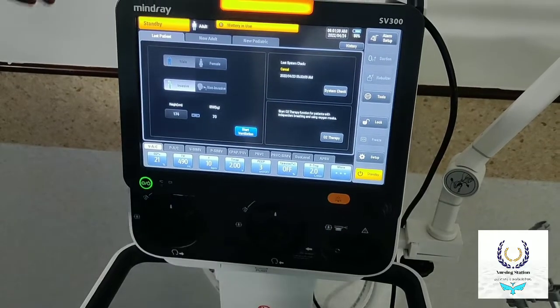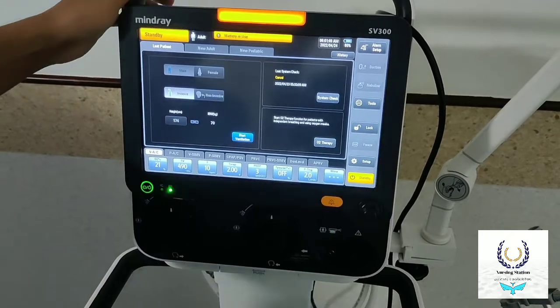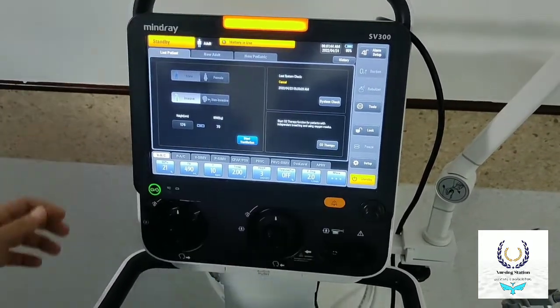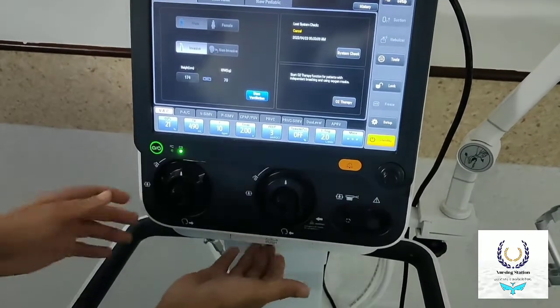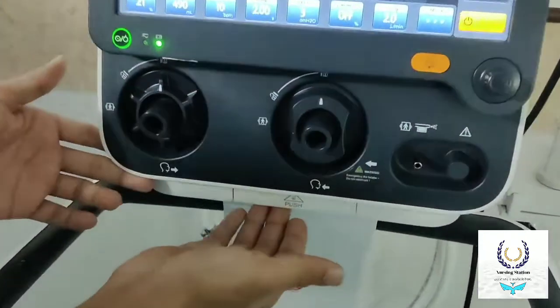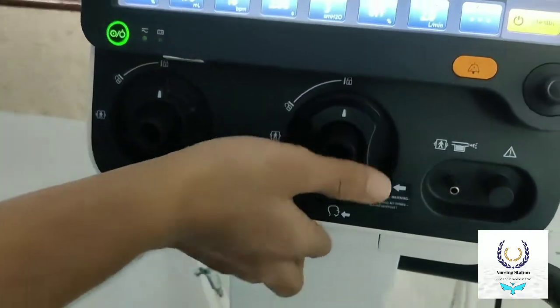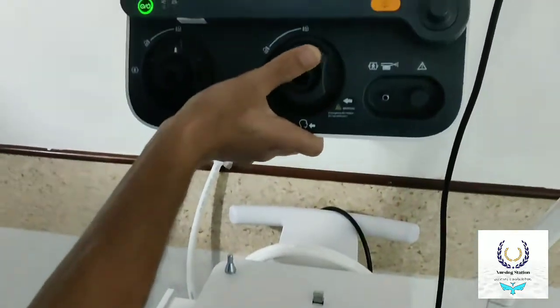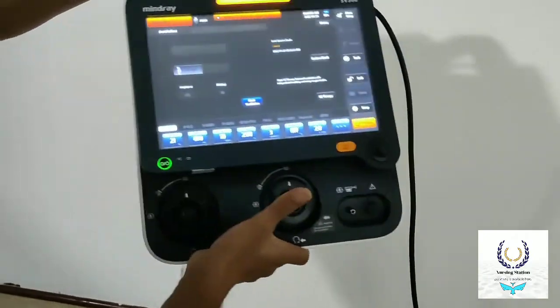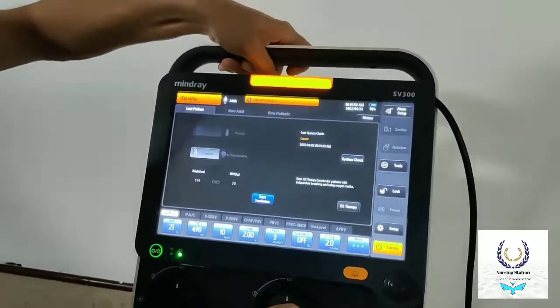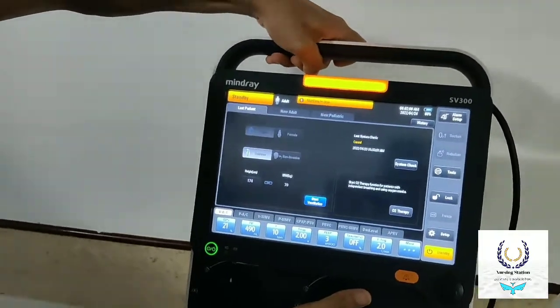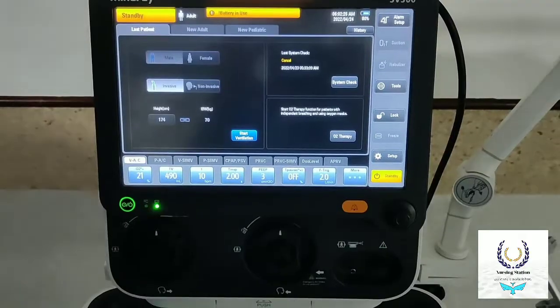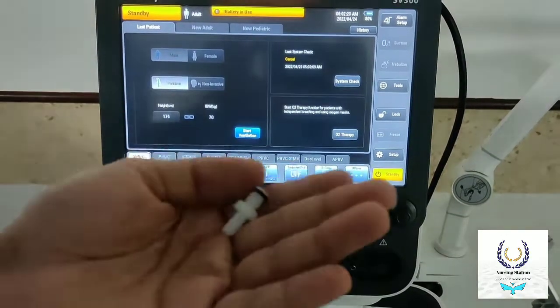Now we are going to show you how to remove the ventilator from the stand. You can see a push button down here — just push it, then pull the ventilator up. You can now use it as a portable ventilator very easily.